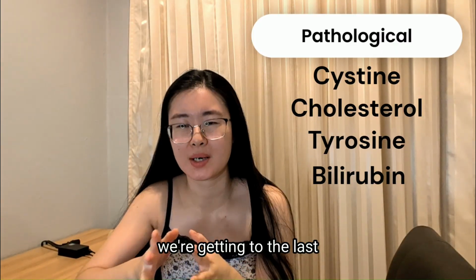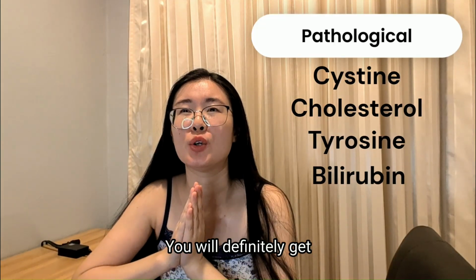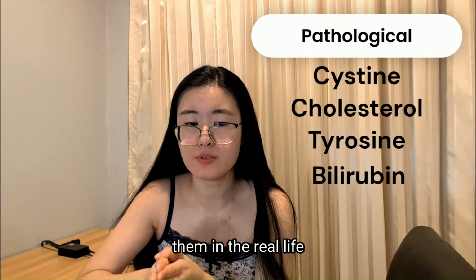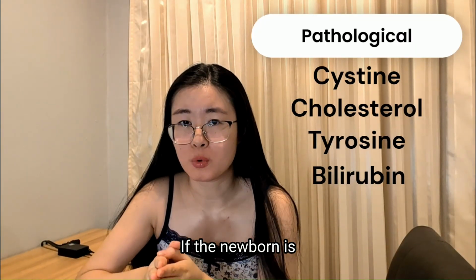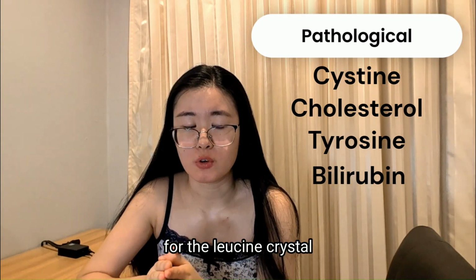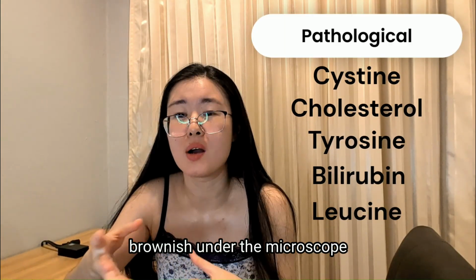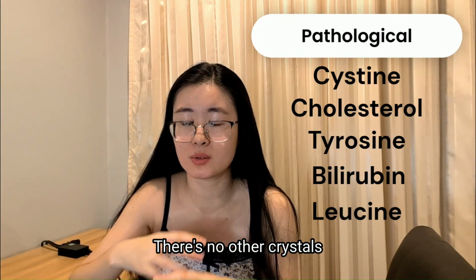And finally, we're getting to the last pathological crystal. And this one is important. You will definitely get this question in your exam because this is the one that could put a newborn in danger and you can see it in real life, and the urine would have such a unique appearance. It's called maple syrup. If the newborn is described as having maple syrup-like urine, then you are going for the leucine crystal. Once you see this, there is no doubt it's pathological and it's dangerous. It is dark yellow brownish under the microscope, and the crystals have concentric rings. There's no other crystal similar to it.